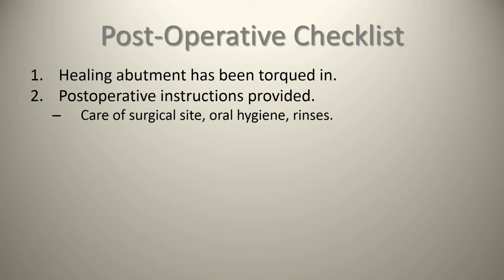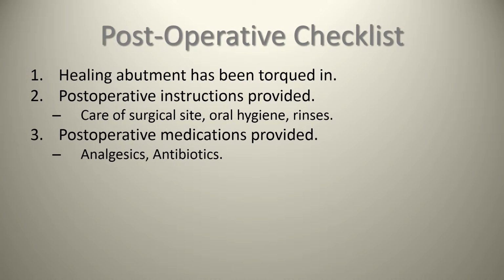So we have a post-op checklist. What you want to basically do is ensure that the healing abutment has been torqued in. There's nothing worse than having a patient tell you that their healing abutment... Many times they don't say healing abutment, they say my implant fell out, which doesn't sound too nice.